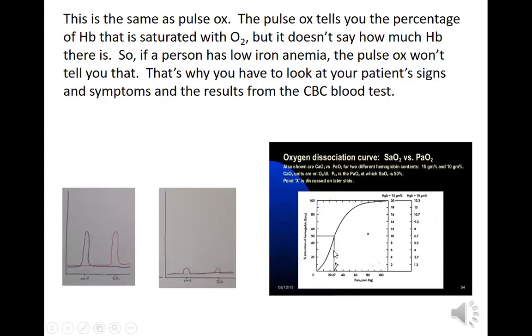I know this is very repetitive. So later on, we're going to take into account the actual hemoglobin number in grams per deciliter. Remember, page 141 tells you the normal hemoglobin value. So 15 is kind of good for both males and females, kind of in the middle, where 10 is low for both males and females, hemoglobin number, right?